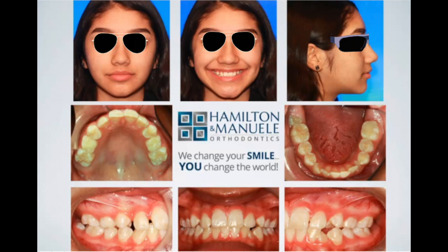Okay, do you see any bulges on the facial? Where is it easier to see bulges, typically? I agree. Yeah, right? On the facial, there's not a lot of tissue there, so you would probably see it if the canines were there. Now, could they be hiding on the palate?